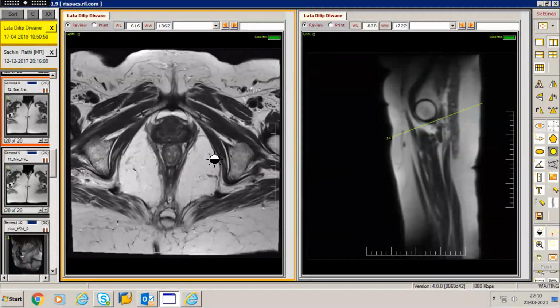Now, did this patient have a tricompartmental prolapse, Swaroop? No, this patient did not. So what did this patient have? This patient actually had no significant findings on his study, and he had symptoms of occasional prolapse, but there was nothing significant identified on the study.